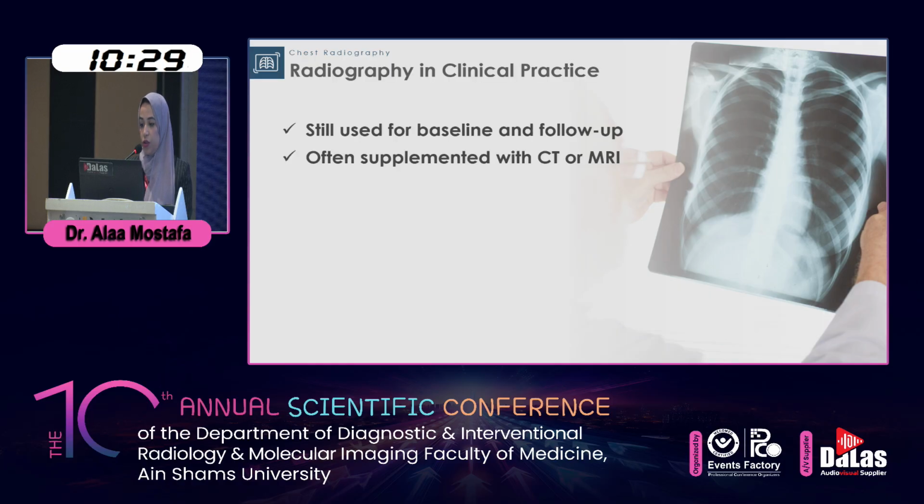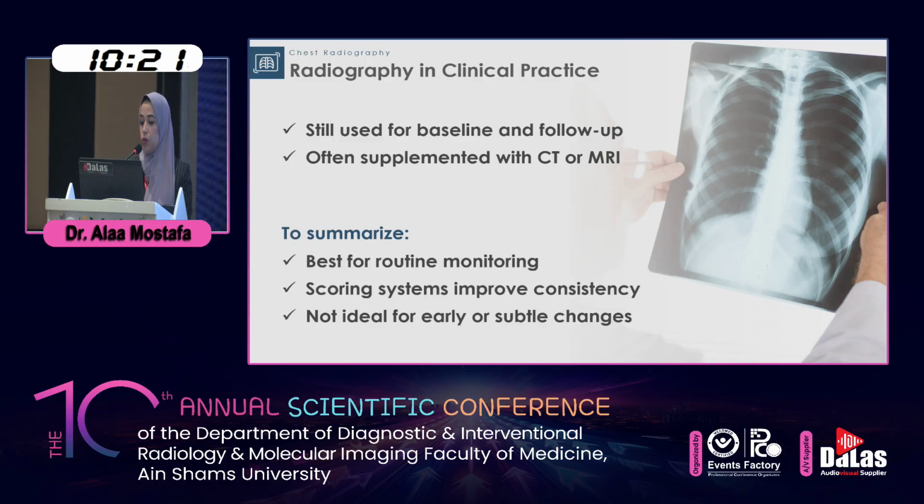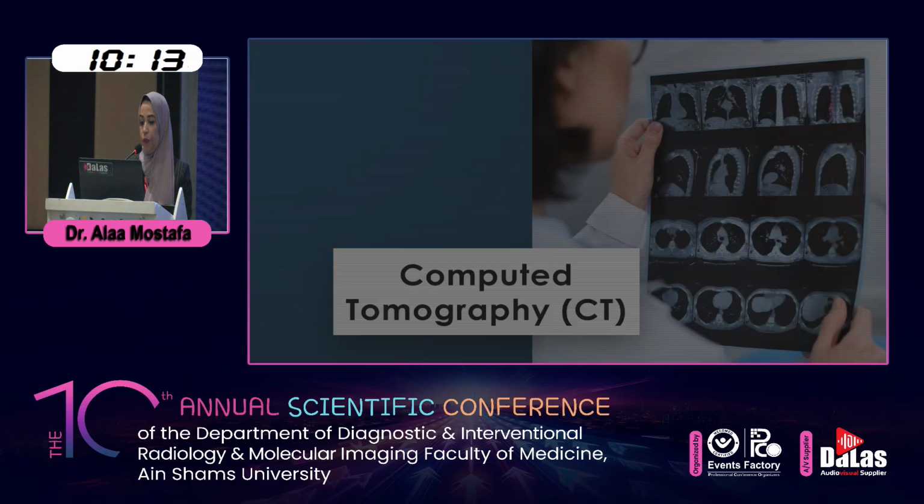Despite its limitations, radiography remains a valuable tool. It's often the first imaging step and helps guide further evaluation. In summary, chest radiography is useful for routine monitoring. Scoring systems improve consistency, but it is not ideal for detecting subtle or early changes in cystic fibrosis lungs.